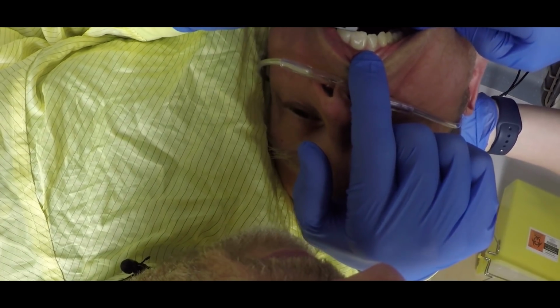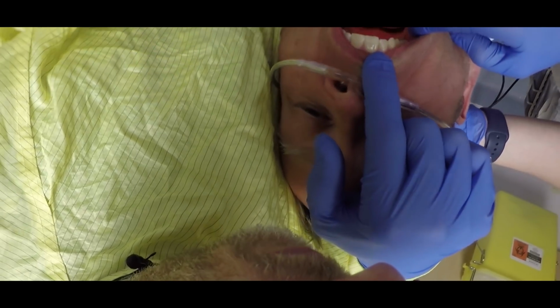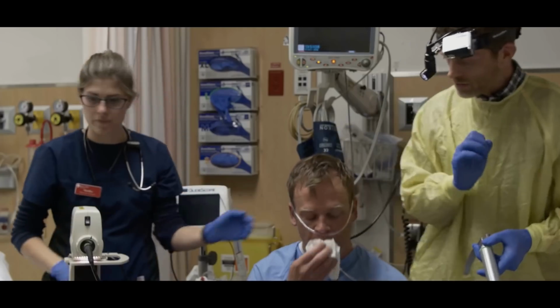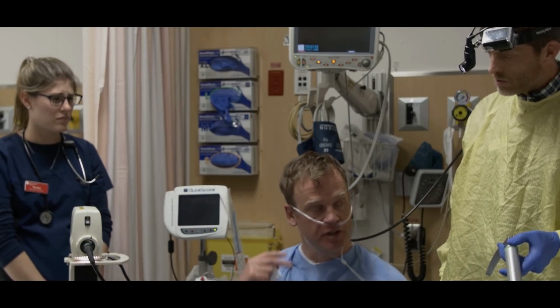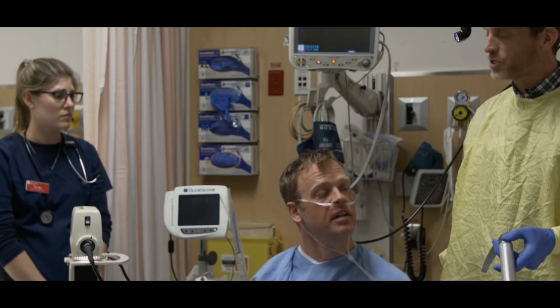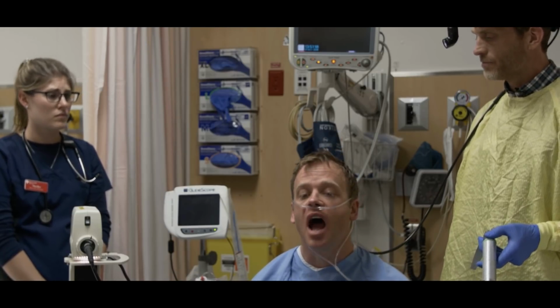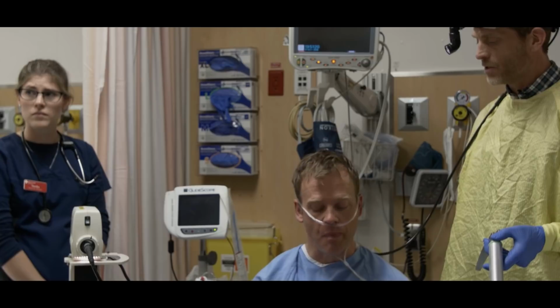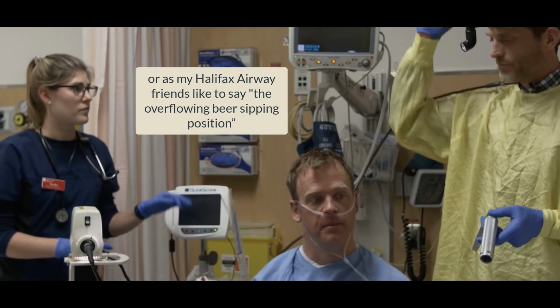You okay? Yeah, okay. Thanks for that feedback. Yeah, little gag. Yeah, take that out. Just give me a second here. Did you have a gag there? No, I just did this a little bit uncomfortable on my neck, actually. Oh, with the cervical extension? Yeah. Okay. I think I'm going straight back as opposed to... okay. Yeah, let's try and get you in a bit more of a traditional sniffing position.